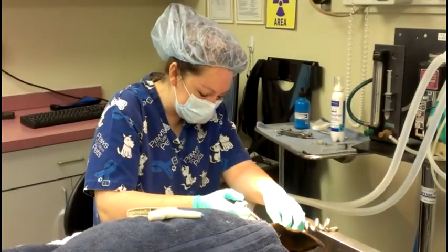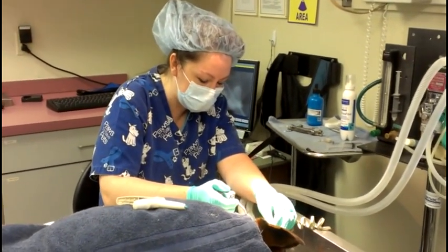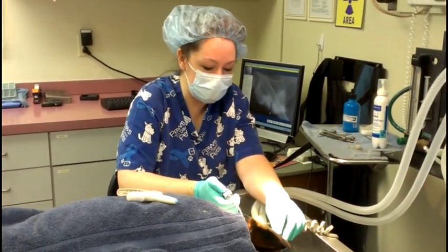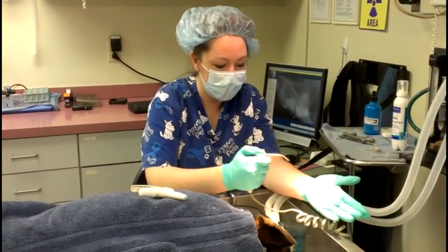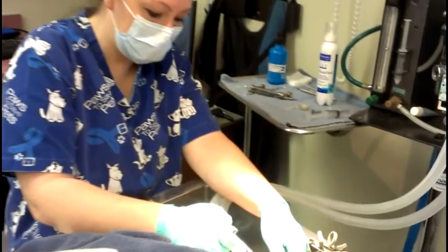Okay, it's been 3 minutes, so it's time to go ahead and get the remaining fluoride off of Mabel's teeth. We don't want to use any water because that'll wash it away. We want it to stay on there as long as possible before she eats or drinks, or we rinse it off. So we're just going to use some air and just kind of get rid of the extra fluoride.